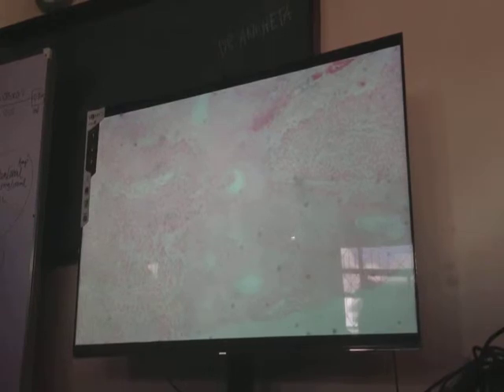The abnormality in this slide is at that pointed area. So you have lobules of hepatocytes. We should not be able to see that appearance in a normal liver, because usually the hepatocytes abut each other. They are very close with each other. We should only be able to see small portal areas. Let us examine the components of this abnormality.